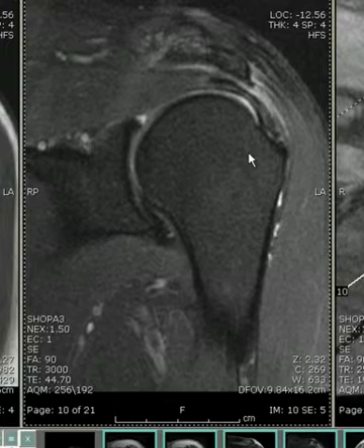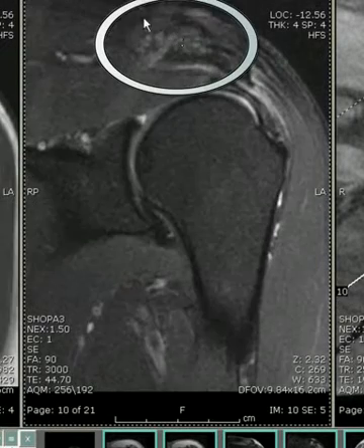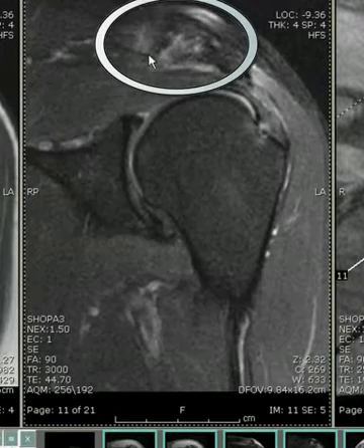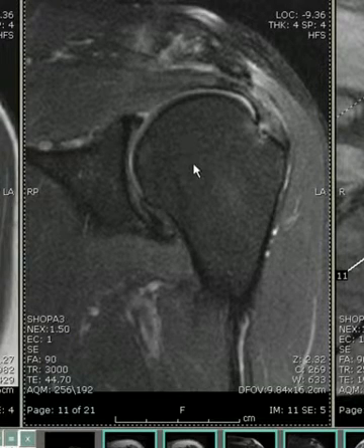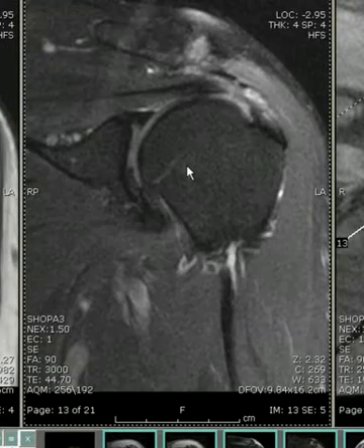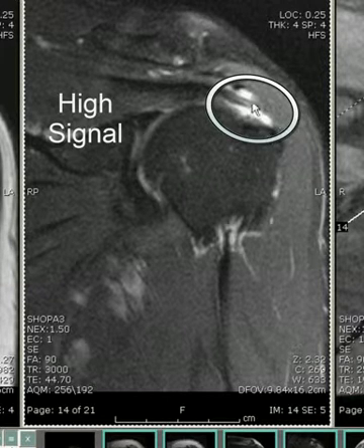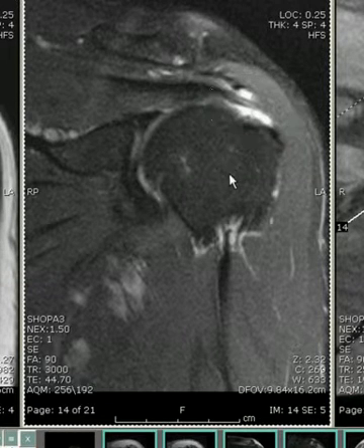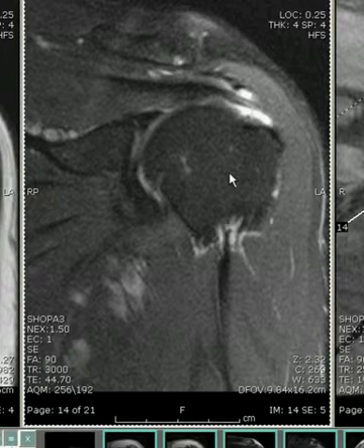As we move more anteriorly, we can start to see the degenerative changes in the AC joint, but notice there is not extensive impression on the superior part of the supraspinatus. More anteriorly, we can see the focal high signal region within the supraspinatus extending through its entire width at the footprint, or the attachment to the rotator cuff.